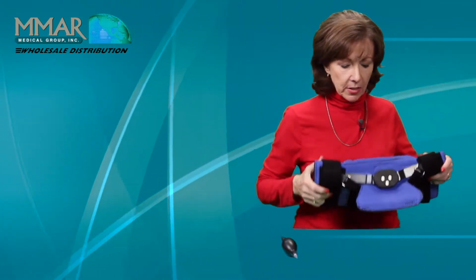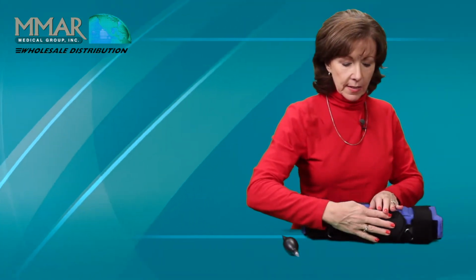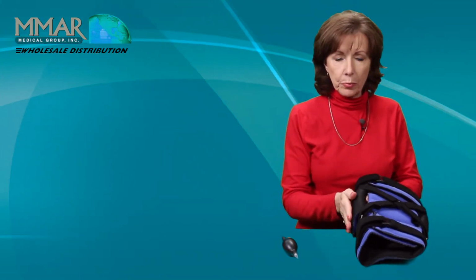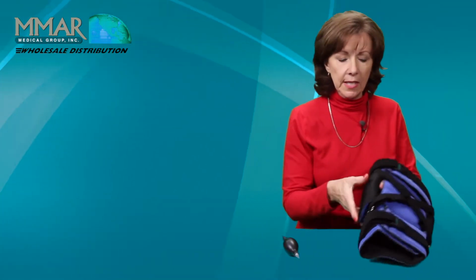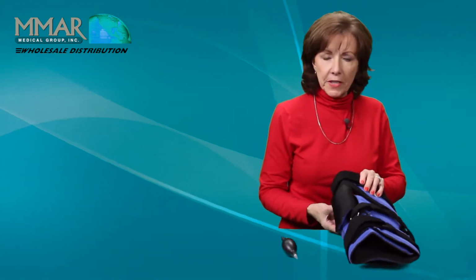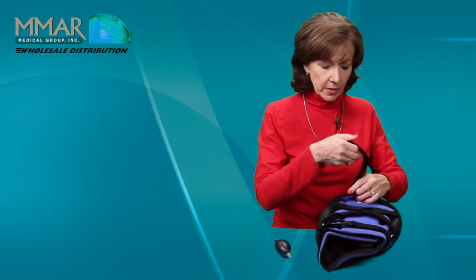They just slide into those slots. Then this goes down not just to protect the other leg from pressure, but also it holds the hinge where it needs to be. These are very simple to fit.